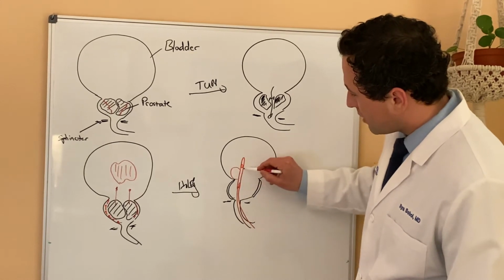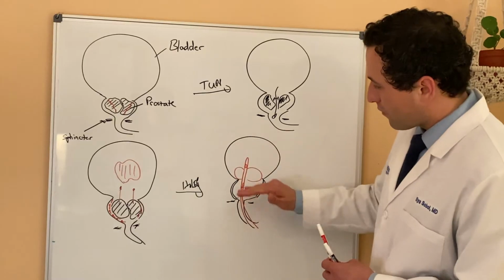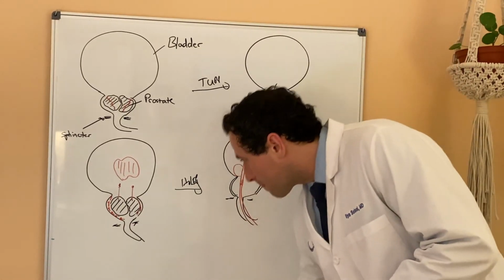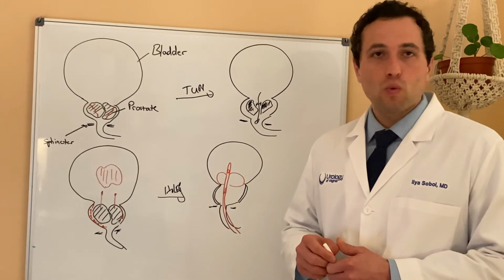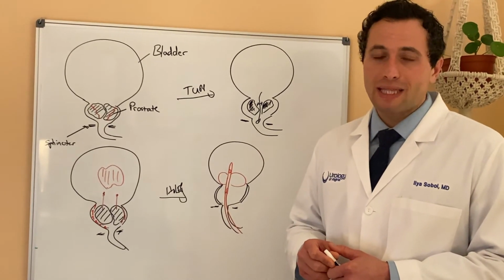Drains the urine, and there's a big balloon that sits here in order to help prevent the catheter from falling into that wide open channel. That catheter typically comes out in less than 24 hours. Sometimes in men, if the bladder doesn't work well and they need a little more time, we may keep it in place for as long as 3 days, but that's pretty uncommon.